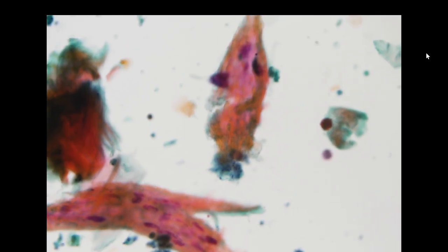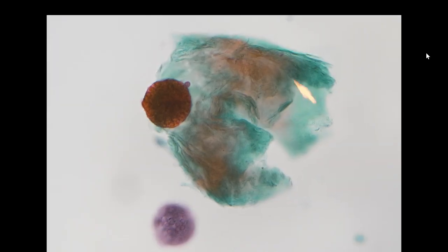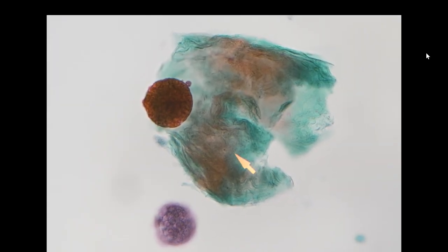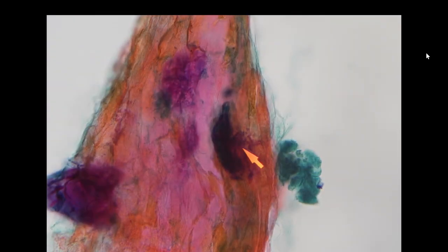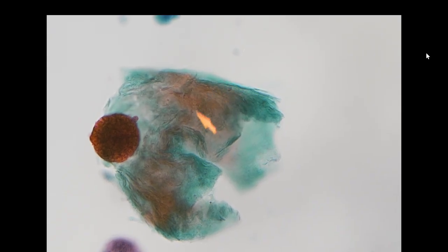And then I called the clinician because last time we already called it compatible with ruptured epidermoid cyst. What happened? So this is keratin material. This is more apparent, right? Because this is not as degenerated as the prior one, but you need to make the distinction. If you see only this degenerated material, you need to know that this is actually keratin. Okay? This is easy, but this is not easy. So the clue is to see this lamination arrangement.